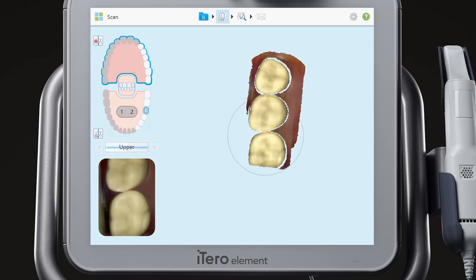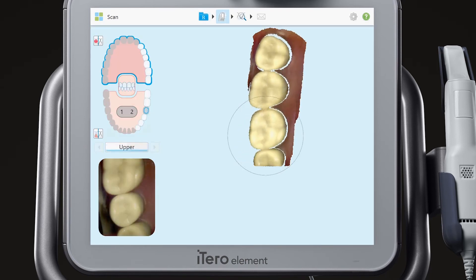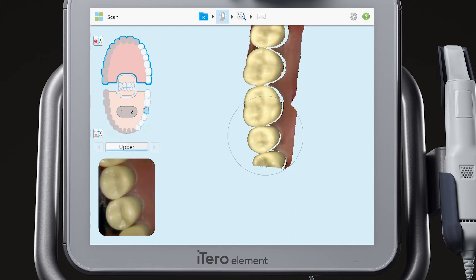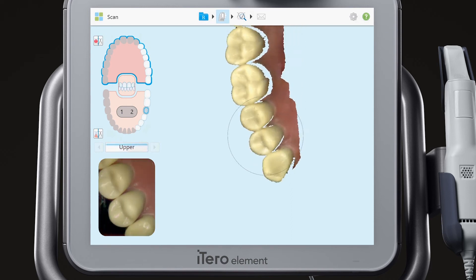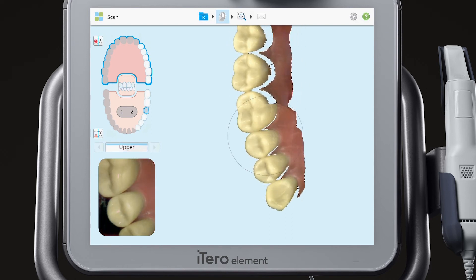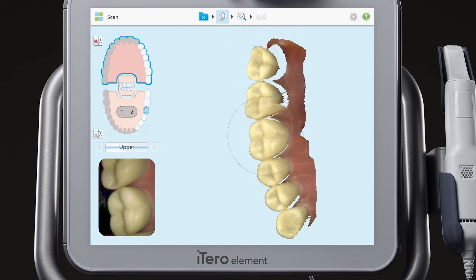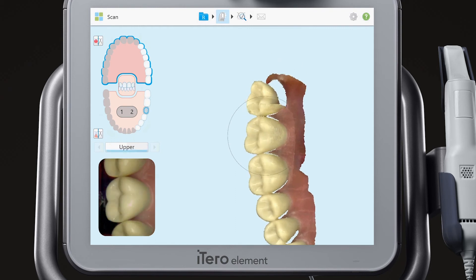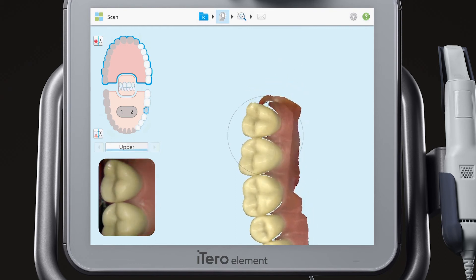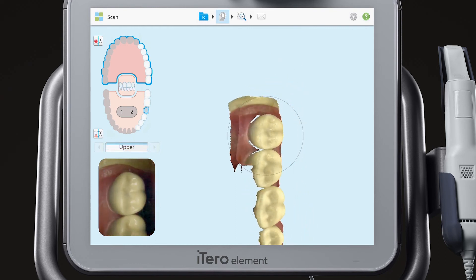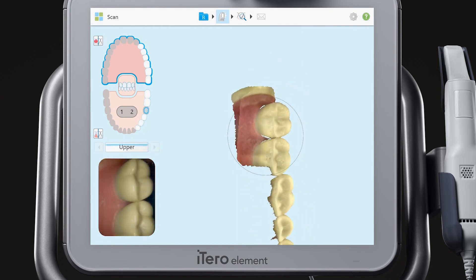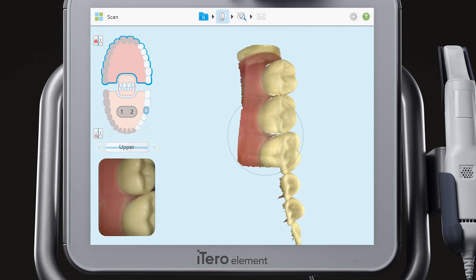Start by scanning the occlusal, lingual, and buccal of the opposing arch.